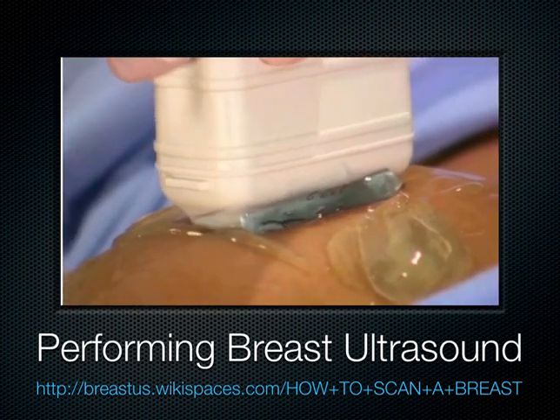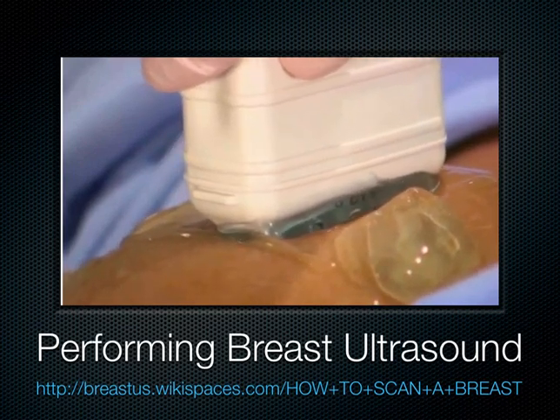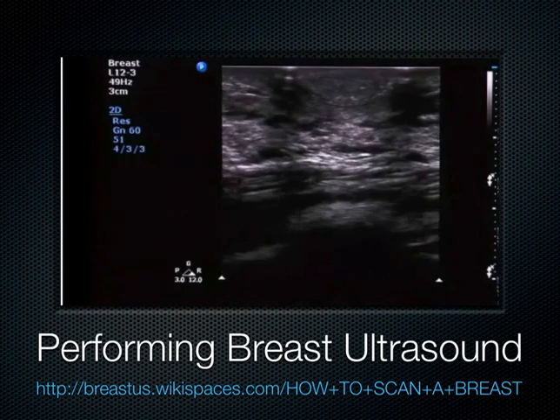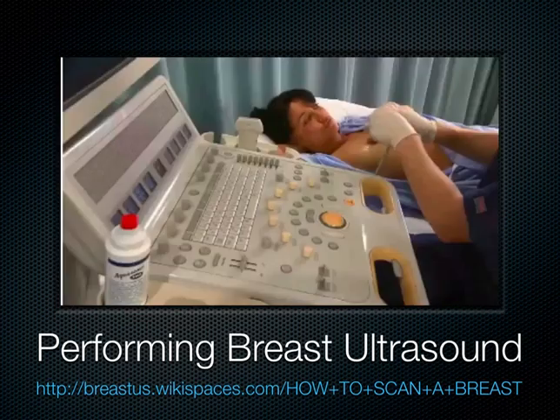If no pathology is encountered, return the transducer to the midline of the nipple in the longitudinal plane. Manipulate the transducer until a representative image of the nipple is obtained. Freeze, annotate, and save the image.